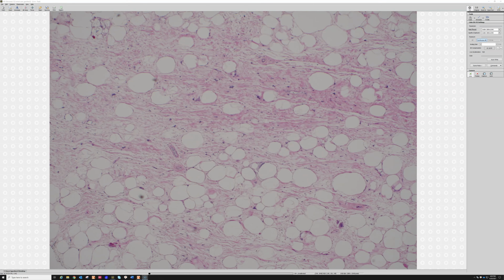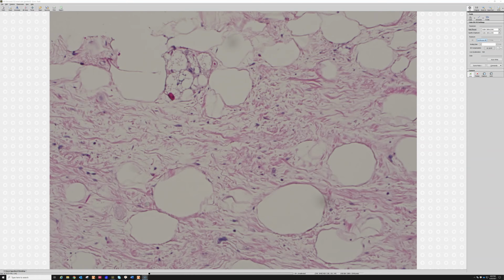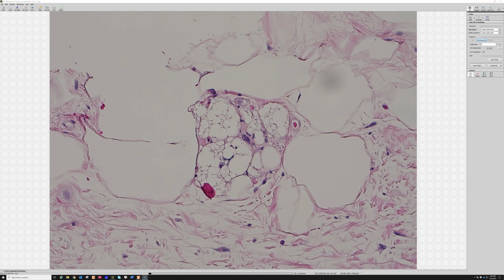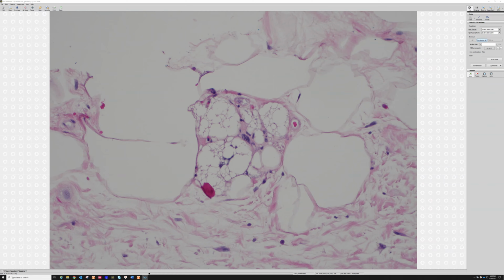Now, I have a whole long video all about liposarcoma 101 that goes into great detail about all the variants of this tumor, well-diff liposarcoma, and also other liposarcomas like myxoid liposarcoma and pleomorphic liposarcoma. There's some nice lipoblasts. I mean, everyone likes finding a lipoblast. It's very satisfying to find them, and they're pretty intriguing to look at visually. Let me get a better view for you. But just remember that they're not required.